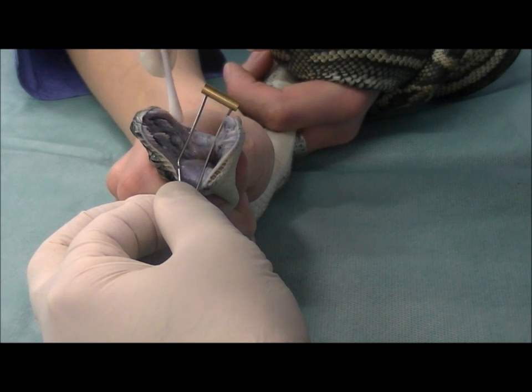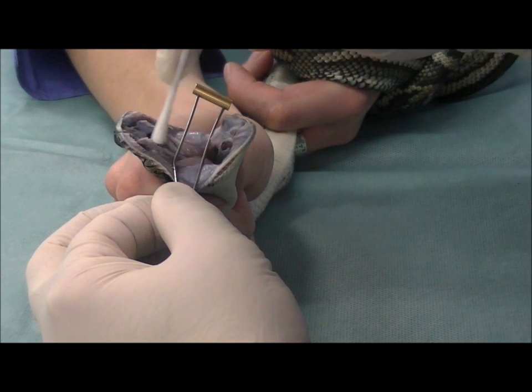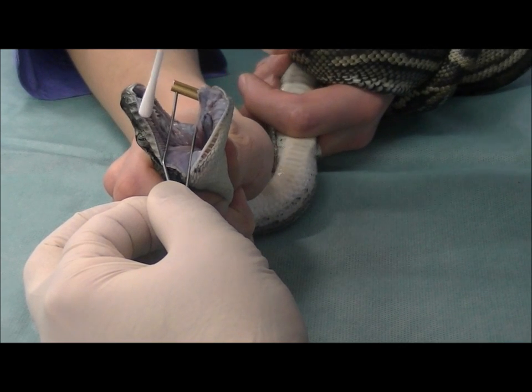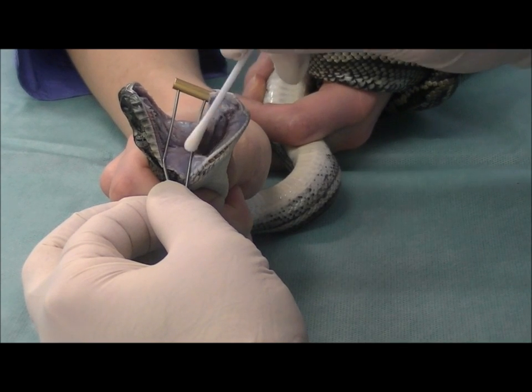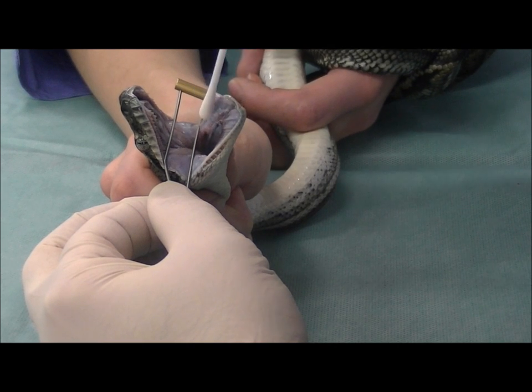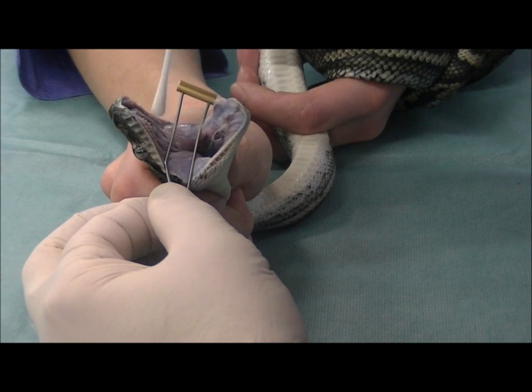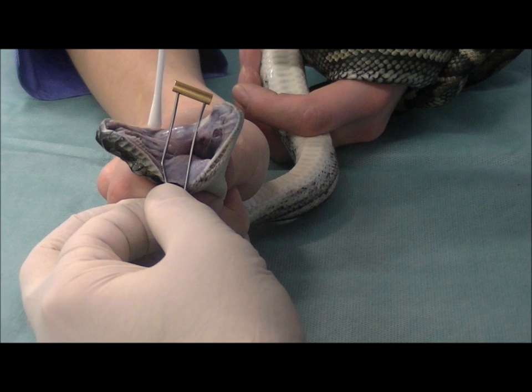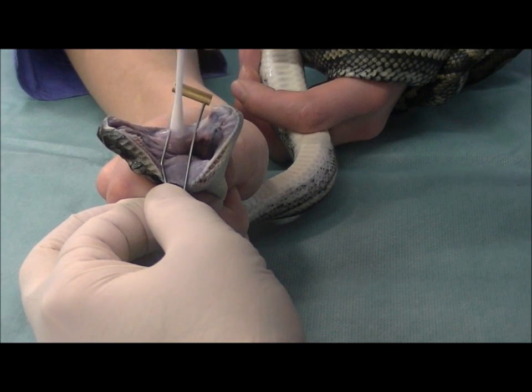Rub down the sides, between the mouth and the teeth, pretty much all over the roof of her mouth and also down on the bottom. Go from the front of the face to the back — that will avoid it getting caught in the teeth, which point backwards. If you try to pull it forward, you will get caught on the teeth. We pre-moisten this swab first by placing it into some saline, and then we take our samples.